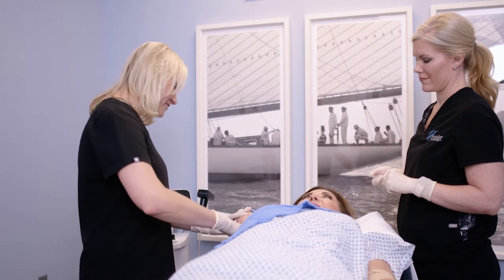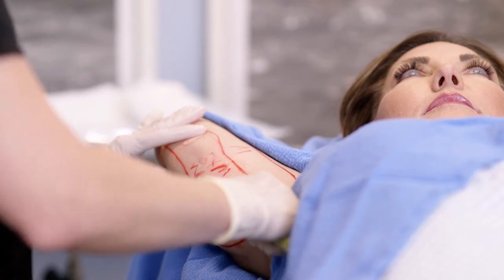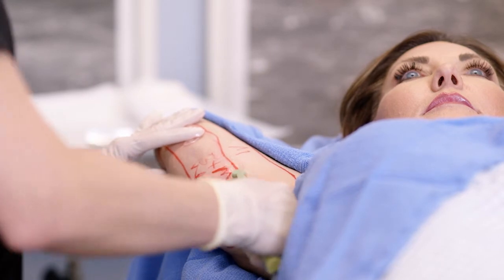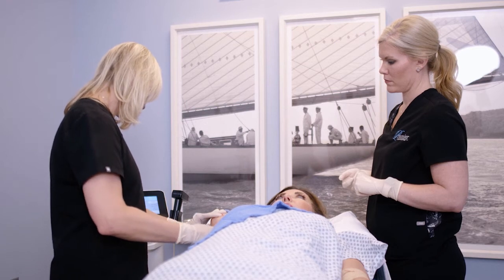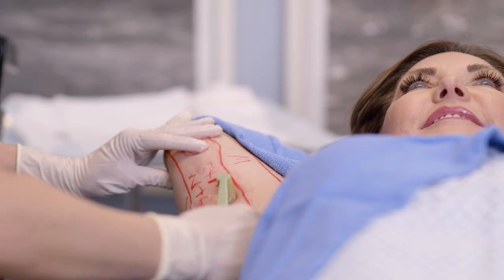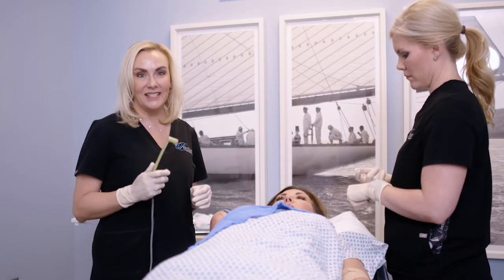Yay. Okay, now we're going to go a little faster, and we're going to get that surface temperature up to 40, because that level is where we've really seen the most optimal results. Sounds like we hit the slot machine. Perfect. So that is all there is to it with the body type procedure.